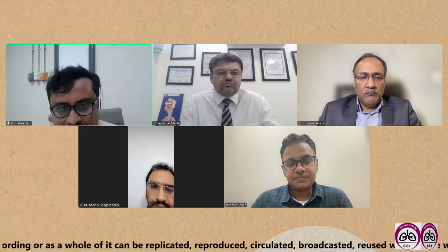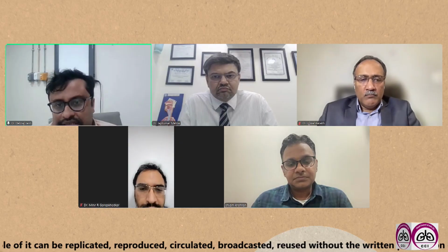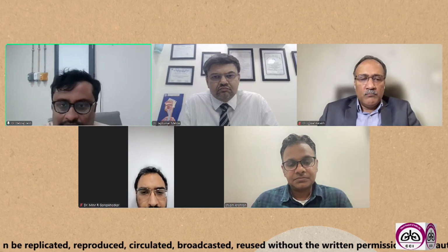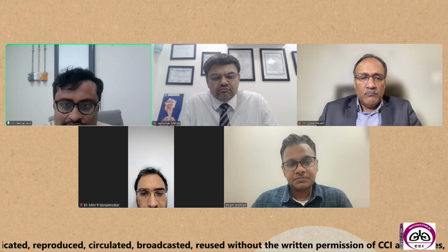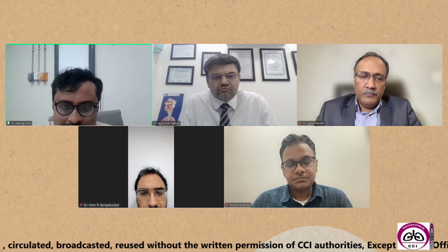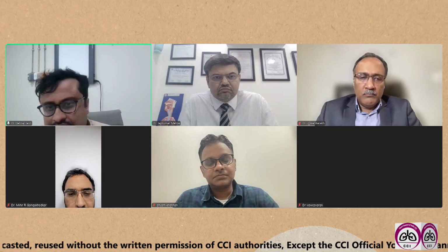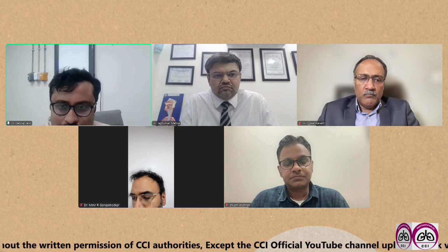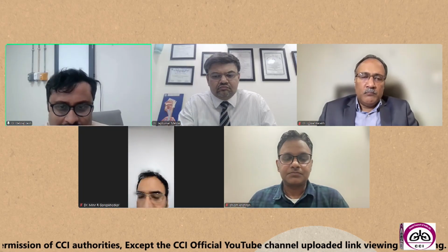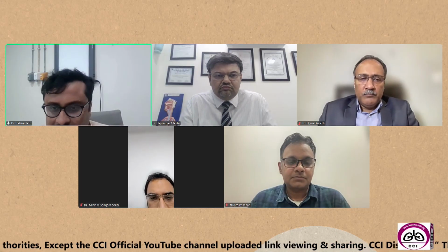Again, well summarized, Sam. So now I will go to Dr. Ujjal sir. Sir, as you are aware, many of the EBUS patients, particularly those having lung cancer, also have COPD. And many times the EBUS procedure takes around 20-25 minutes, so you are giving a lot of sedation, and because the patient has a borderline lung condition, the role of the anesthetist becomes very critical.